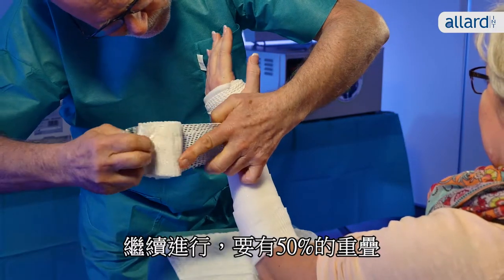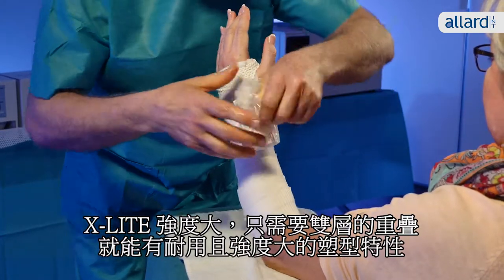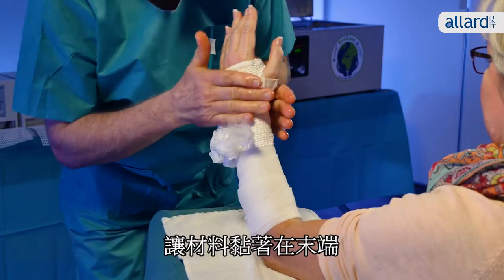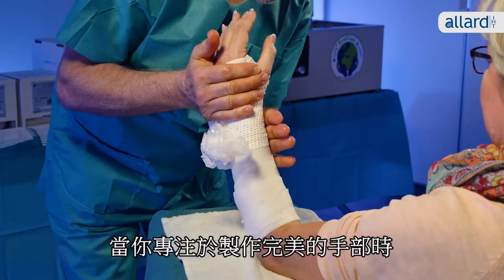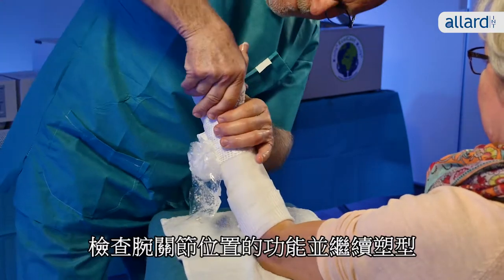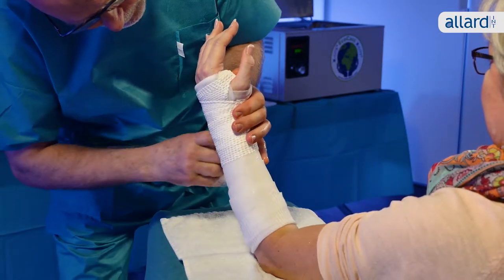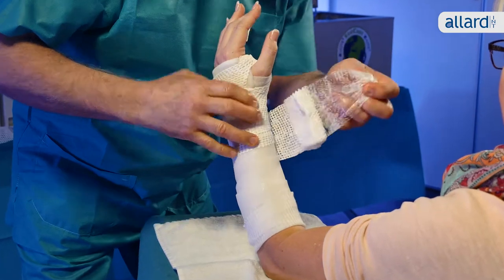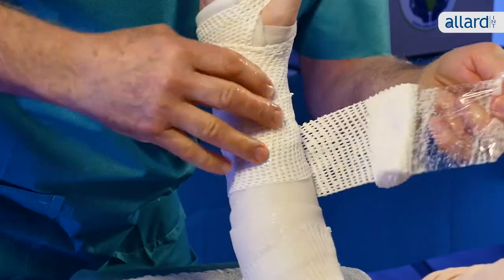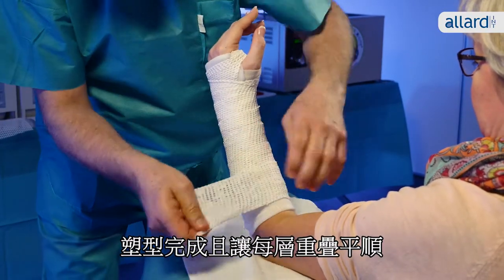Continue to work your way around with a 50% overlap. X-Lite is strong, so you'll only need a double layer to make a durable, strong cast. Allow the roll to adhere to the extremity while you concentrate on creating a smooth fit around the hand. Check that the wrist is in a functional position and continue casting. Finish the cast and smooth the layers so they laminate well.